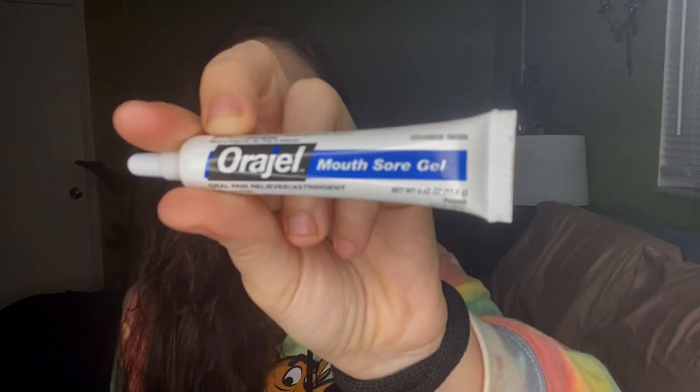This is Orajel for sore mouth sores — for whenever I get cold sores. And this is the little contraption they give you to loop around the rubber bands. Basically you take this little tiny hook and haul the band into place. I've actually never used it — I don't think it's really that helpful.